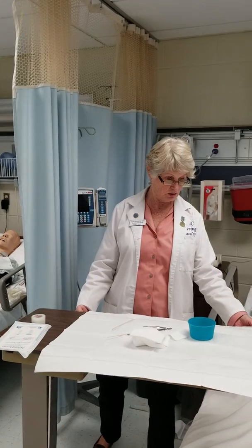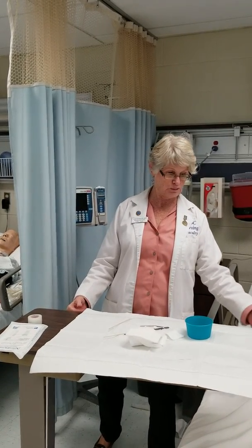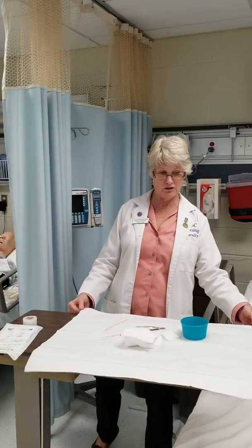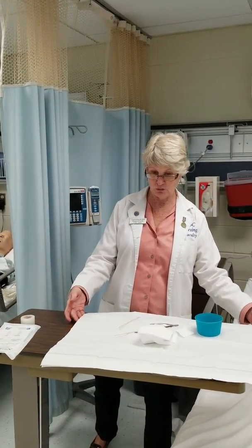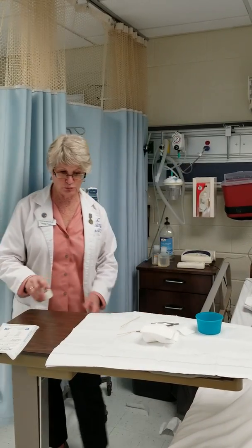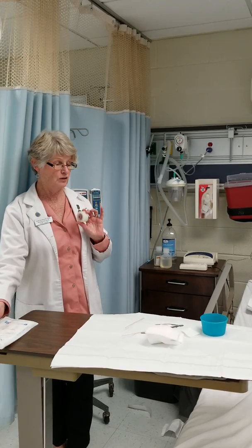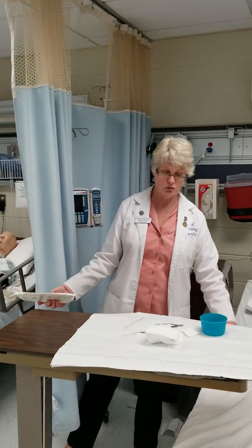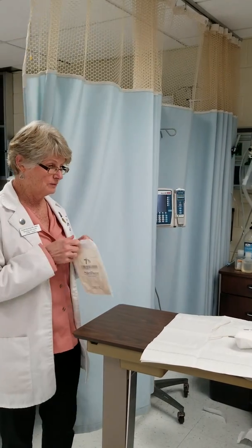Now at this time, my table has to be at an elevated level so that the patient's covers are not hitting the sterile field. And I'm going to move this down just a wee bit so I have room to put on my gloves. I do not need to put this tape on there, that is not sterile, and so I'll save that for last when I tape up my dressing.